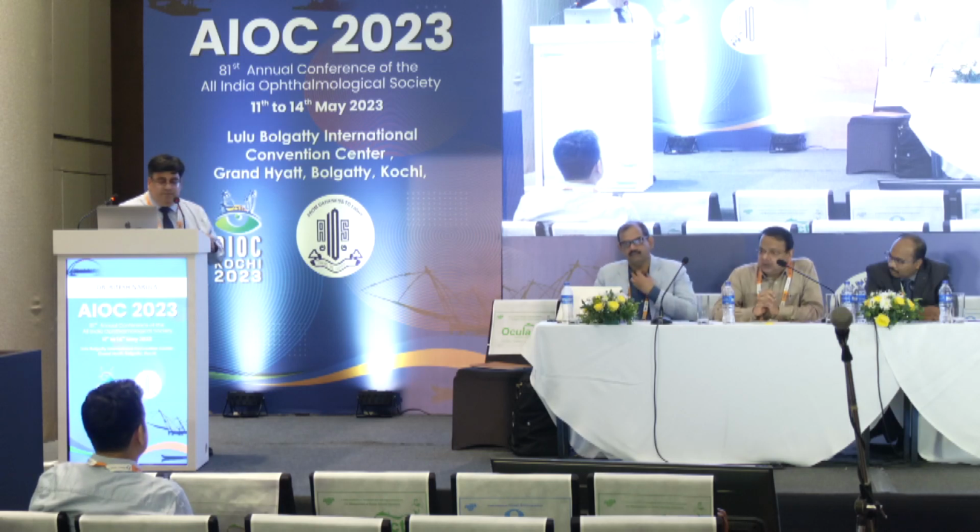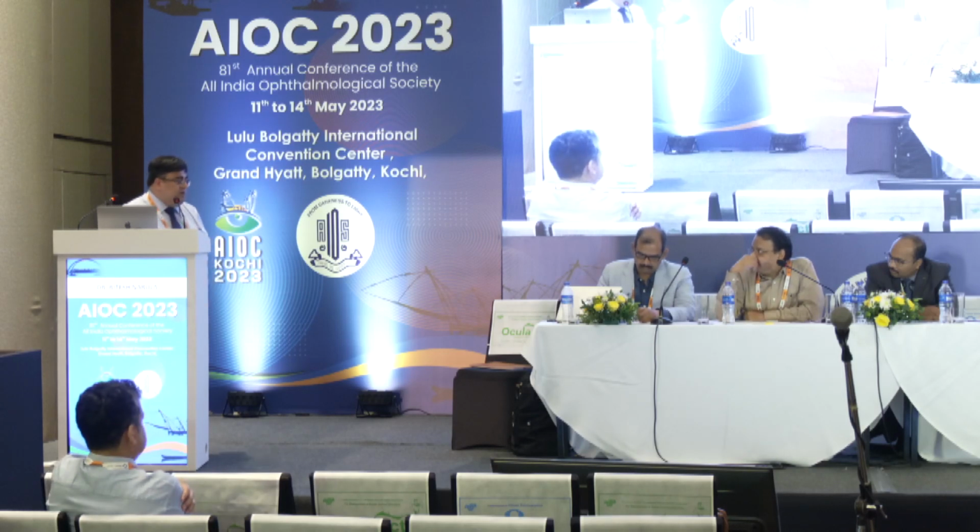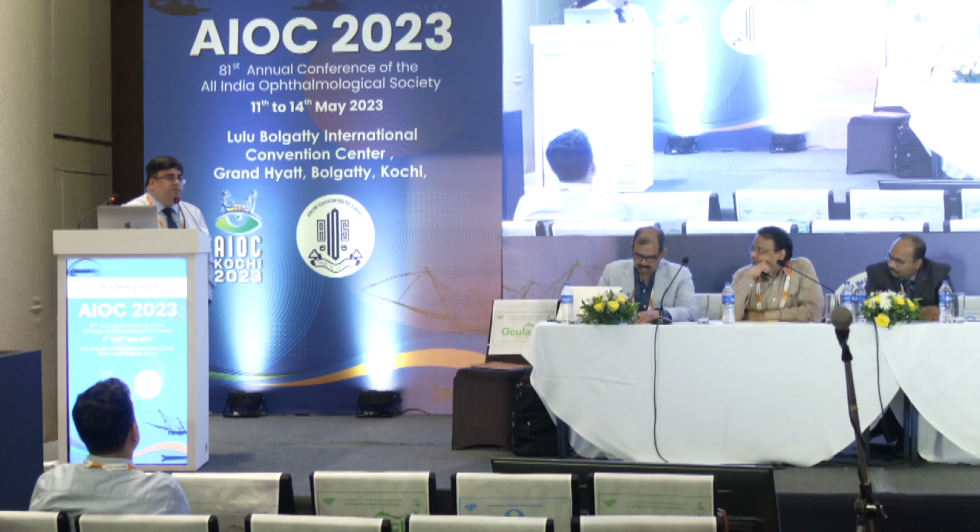How are the fast tracking systems reducing motion artifacts? Now, most of these machines have their own tracking system, all the recent models. So the amount of motion artifacts, unless the patient is not at all fixating and is not able to hold their eye, the minor saccade-based motion artifacts, most of them have a way to tackle it.